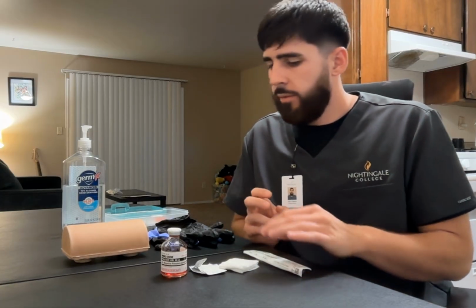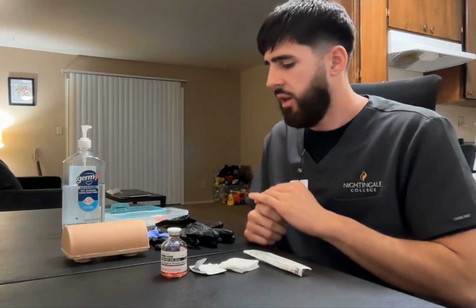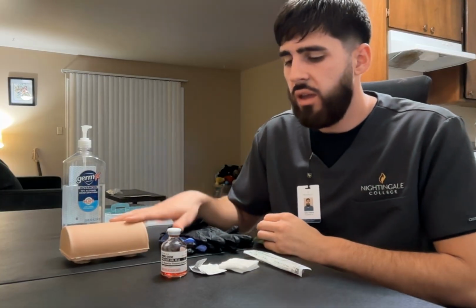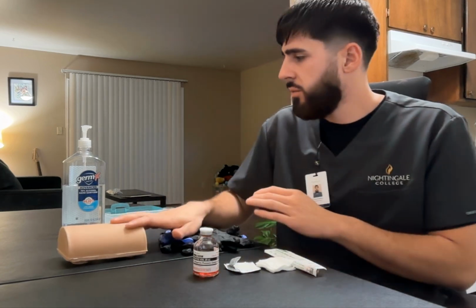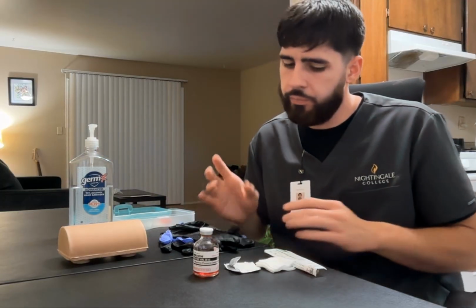Of course, when administering any type of medication, it's important to remember and keep in mind the 6 rights of medication administration, which are the right patient, the right drug, the right dose, the right time, the right route, and right documentation. With those things in mind, I'm going to be looking at my patient here, Mr. Smith. I don't know if I went over my supplies. I have my syringe, gauze pads, alcohol pads, my drug, clean gloves, Mr. Smith here, my patient, my hand hygiene, and a sharps container.